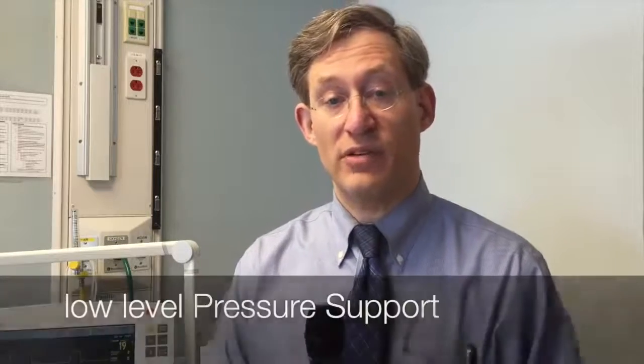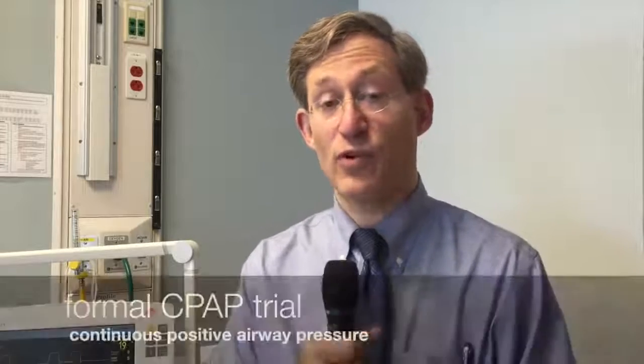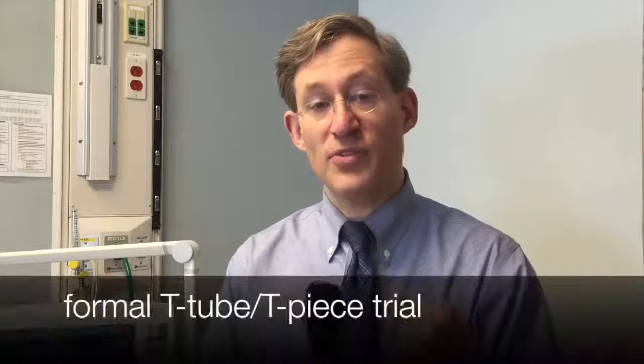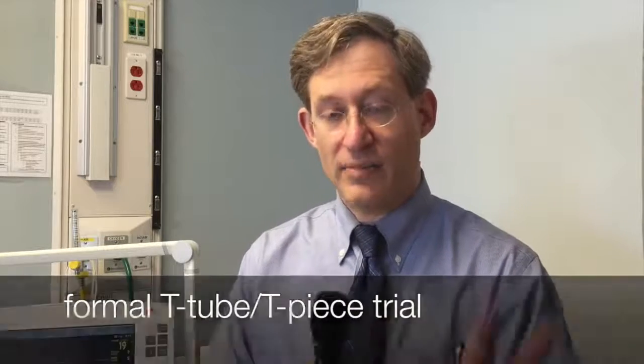You can either put the patient on low levels of pressure support, and we'll talk about pressure support in a little bit. You can put the patient on formal CPAP, continuous positive airway pressure, or for certain patients, such as subgroups of patients who have a low ejection fraction, you might want to put them on a formal T-tube trial. And I'll talk about the 3 different types currently.